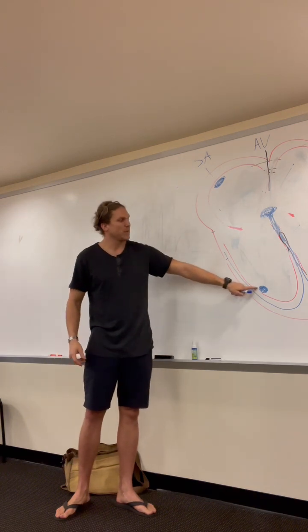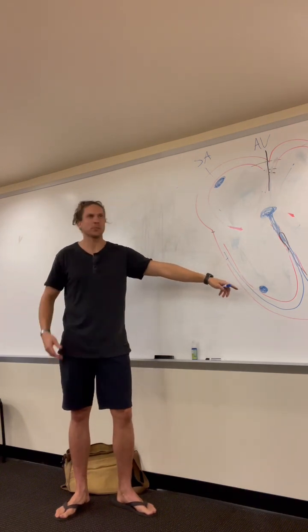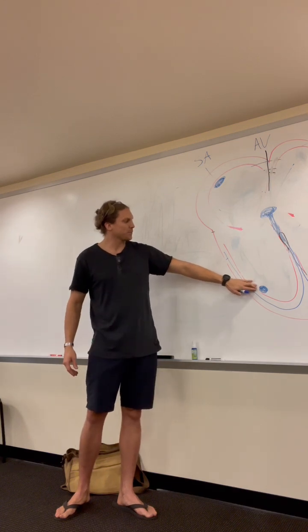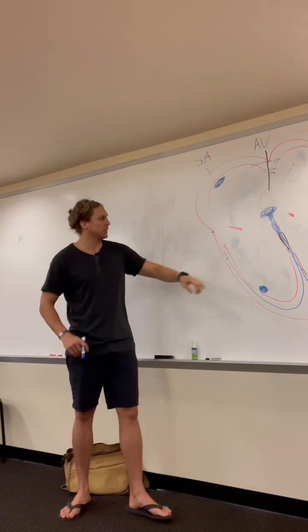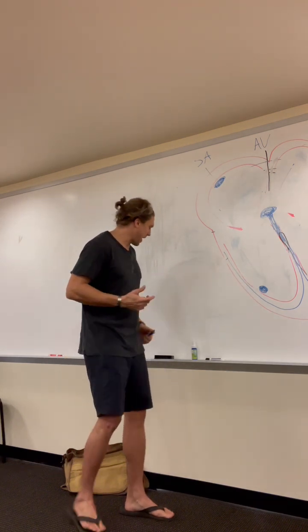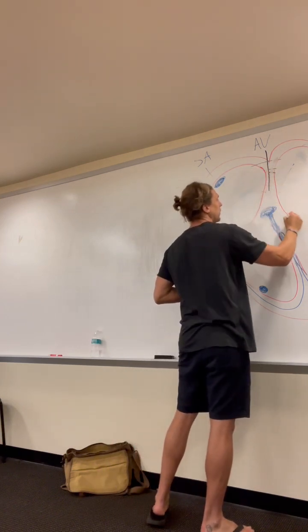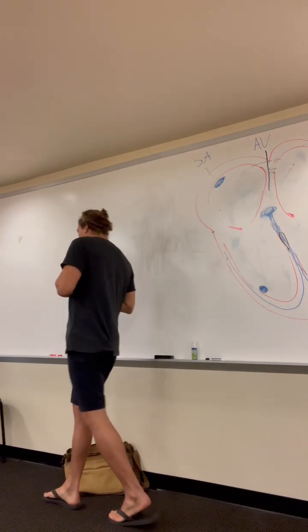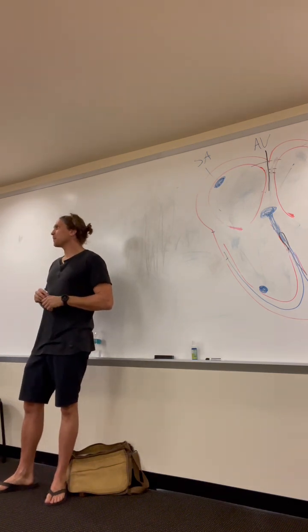So this one focus takes over, and it doesn't beat at its intrinsic rate. This is a really sick person. So the focus sends electricity to the whole heart and tries to be that primary pacemaker. So let's go through systematically and see if we can figure that out with the method. So rate, I think I said earlier, was about 200.